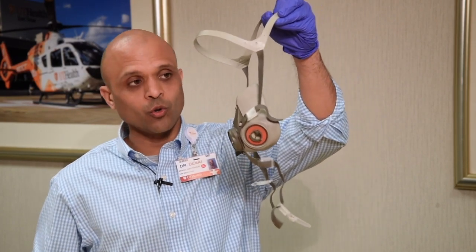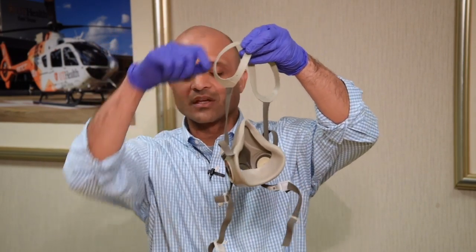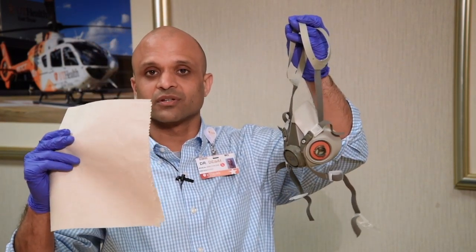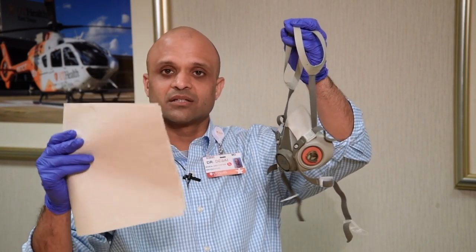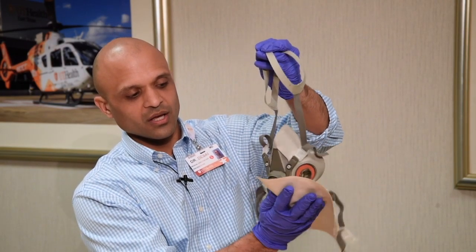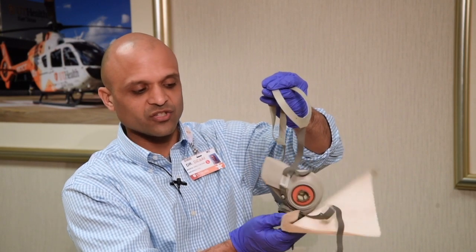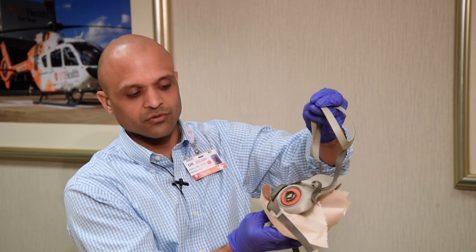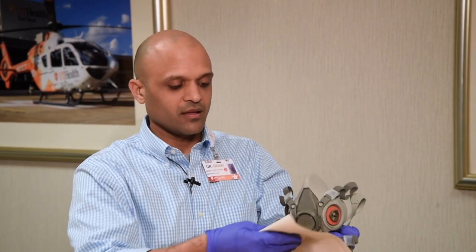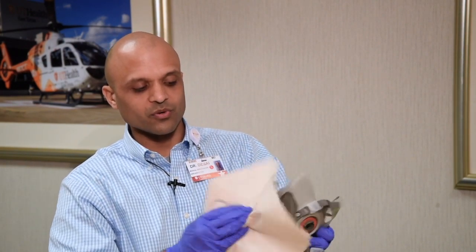As you're holding it from the top, grab both aspects of the halo and get a clean disinfectant wipe — I'm just using a paper towel here for the sake of conserving our disinfectant wipes — and begin to wipe the outer surface of the mask itself. If you can disinfect the bottom of the mask first, that will allow you to grasp the mask from the bottom at that point.